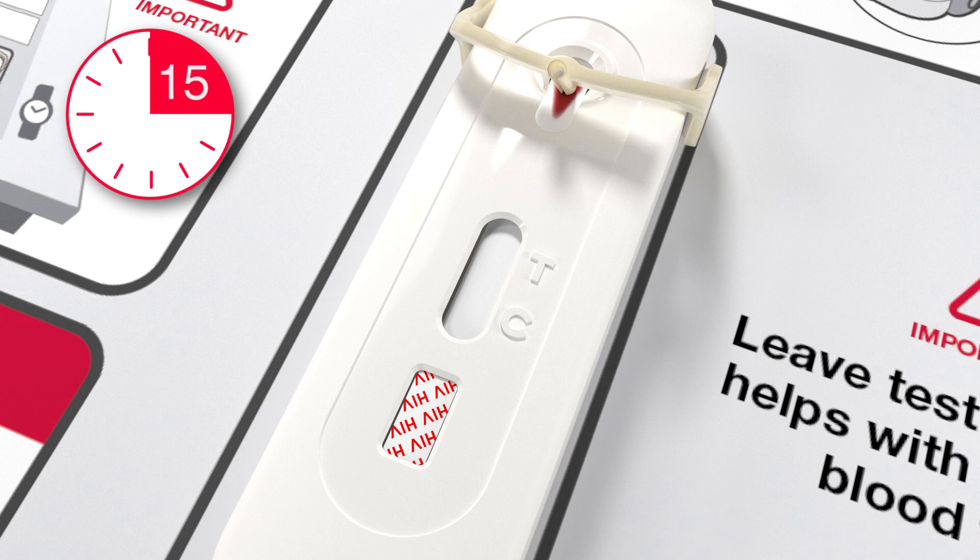Reading the result before 15 minutes could give you a false result. However, do not wait longer than 20 minutes.